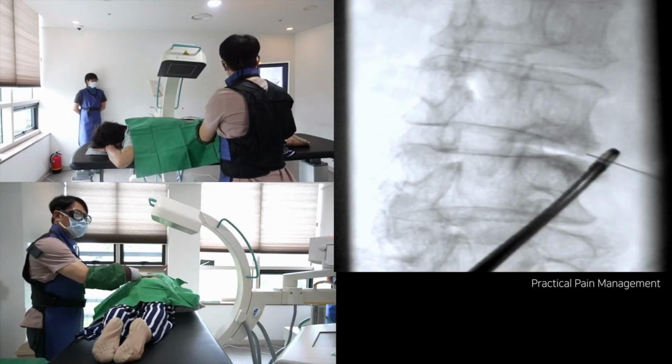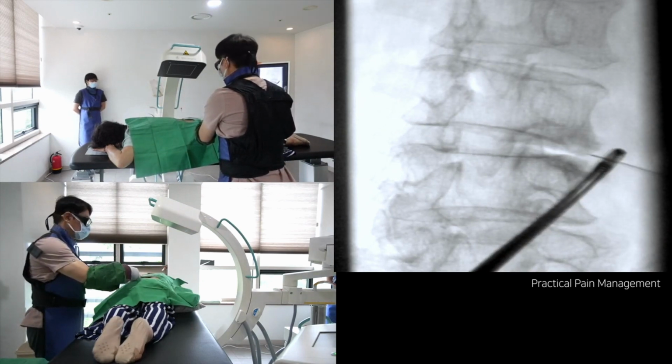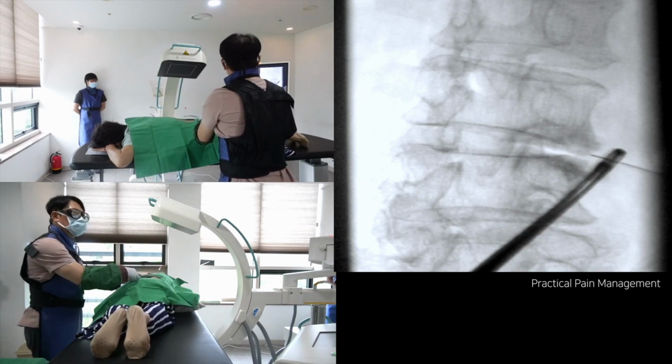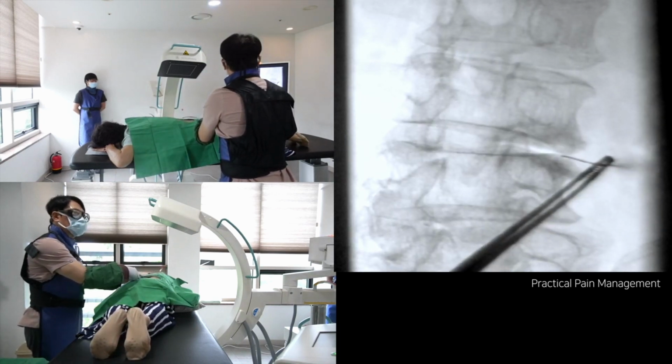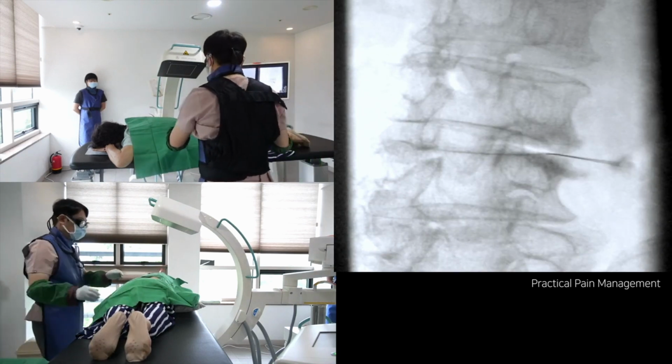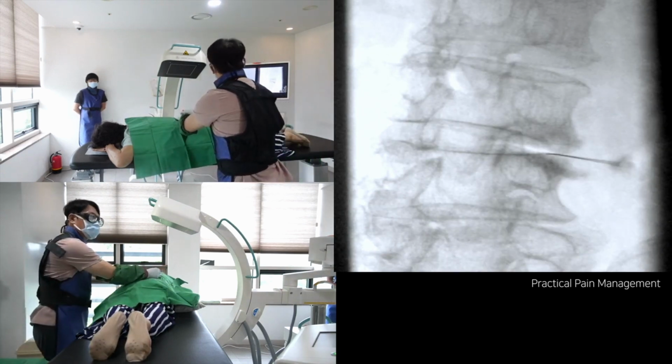The lumbar intradiscal injection. Intradiscal steroid and botulinum toxin injection is an emerging treatment approach for managing chronic discogenic lumbar pain, particularly when associated with posterior annular tear and subchondral bone marrow edema characterized by Modic type 1 changes.